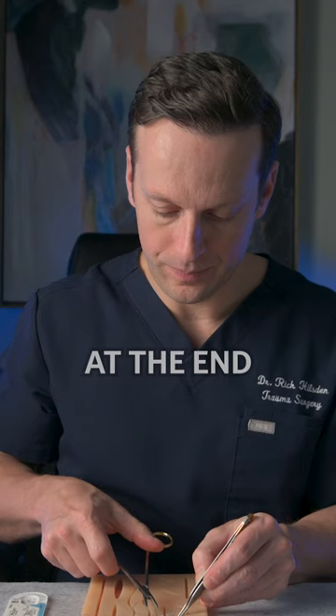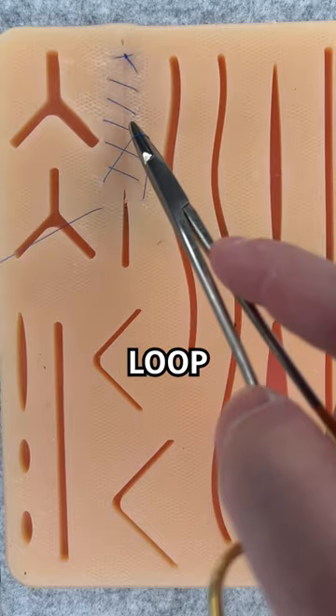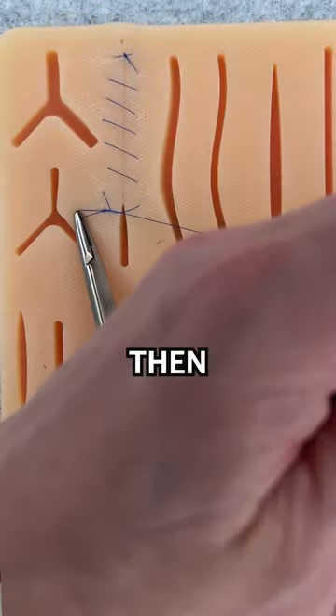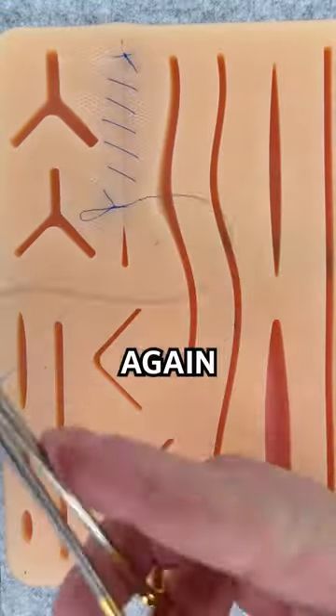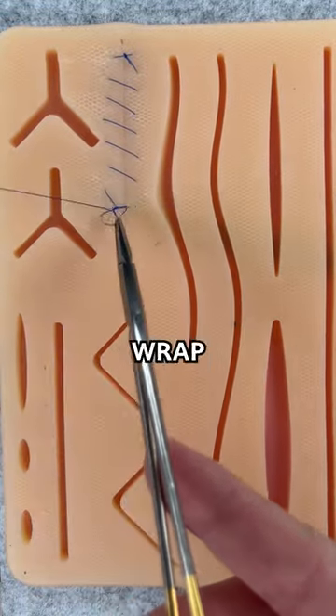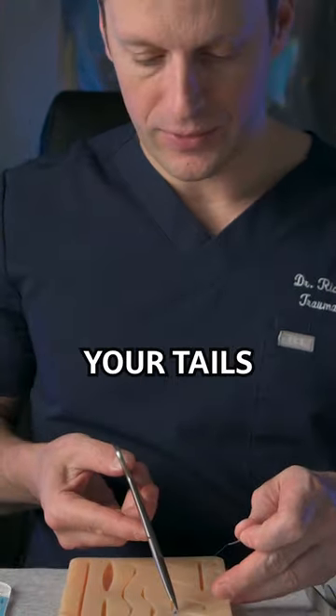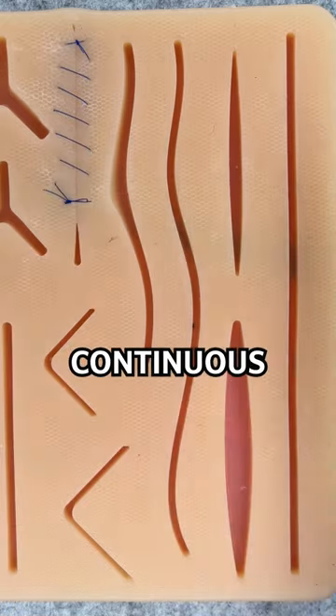At the end, you leave a loop, do your double throw, grab the loop at the very top and pull down. Wrap around again, grab your loop again, then wrap a third time and grab your loop a third time. Finally, cut your tails to complete the simple continuous stitch.